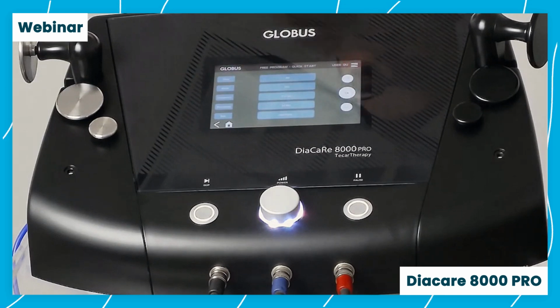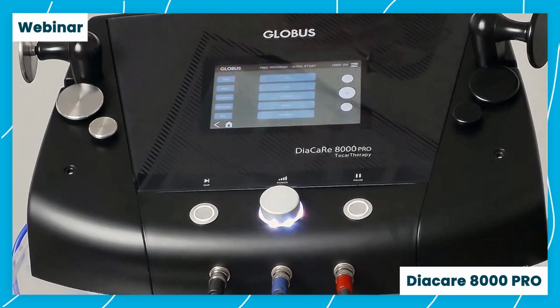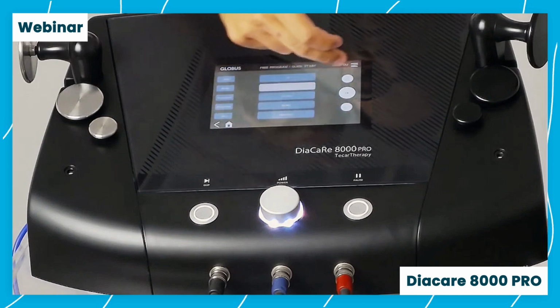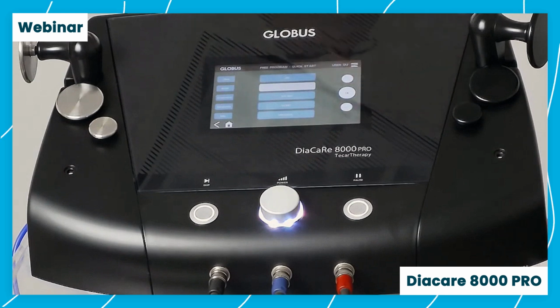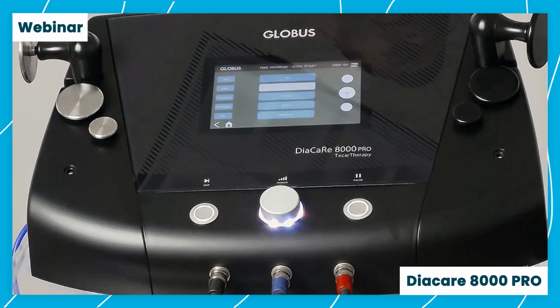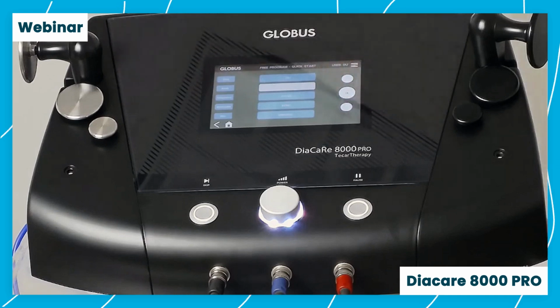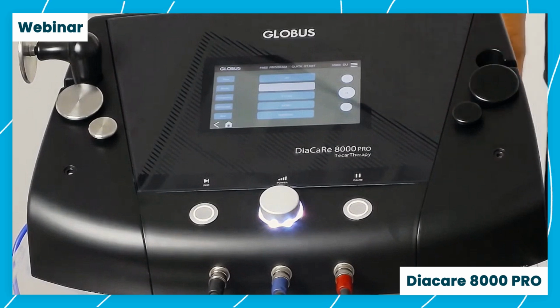Things to consider now. What size of the head are we going to choose? We're using the low back, so we can use a bigger head for the active electrode here. And we're going to start in a capacitive form because we're going to warm up that tissue, okay? So we're going to go for that superficial warmth. We're going to be moving it around local to the head of the electrode, and we're going to start moving through the structures like the muscles in his low back. Then I'm going to show you, we're going to go into more of the resistive as well, okay?